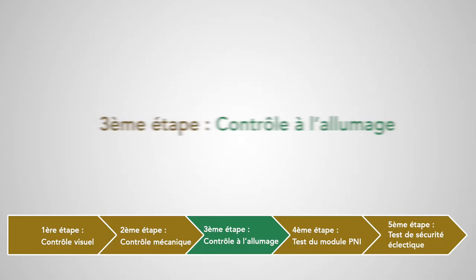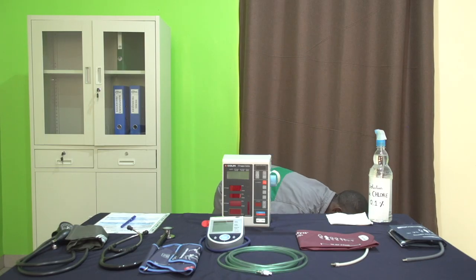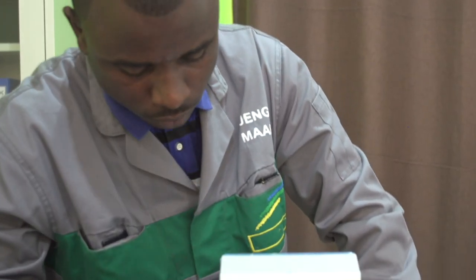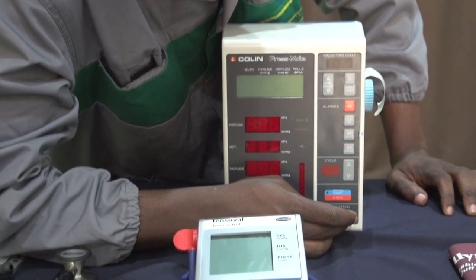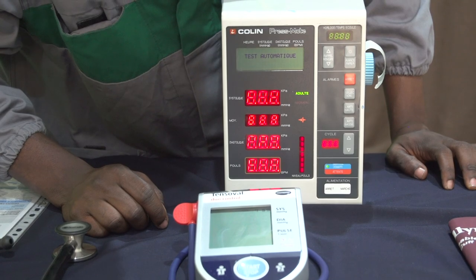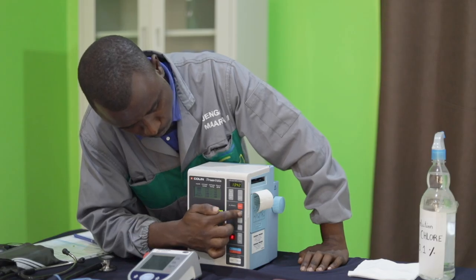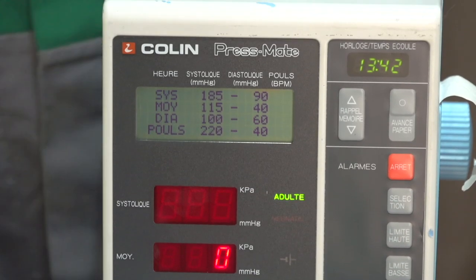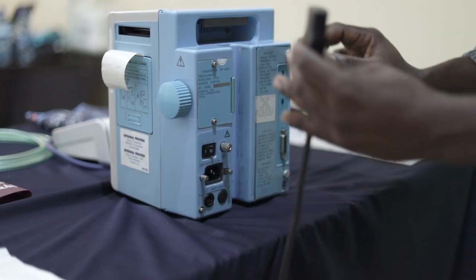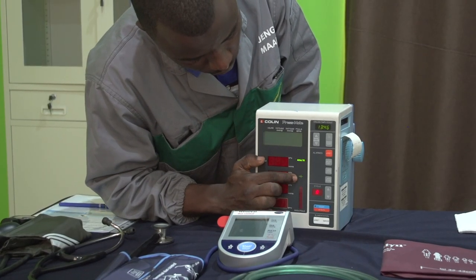Troisième étape : contrôle à l'allumage. On branche et allume l'appareil pour vérifier que tous les voyants et les bips sonores se déclenchent à l'autotest. On vérifie l'état de l'écran — s'il est en bon état, s'il n'est pas cassé et si les inscriptions qui s'affichent sont visibles. Ensuite, on vérifie le fonctionnement de tous les boutons de réglage. Si l'appareil a une batterie, on le débranche et on continue les tests sur batterie. Si possible, on observe les ventilateurs et on vérifie leur bon fonctionnement et leur propreté.